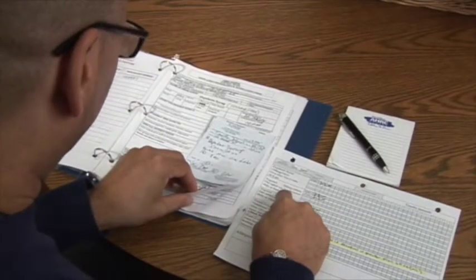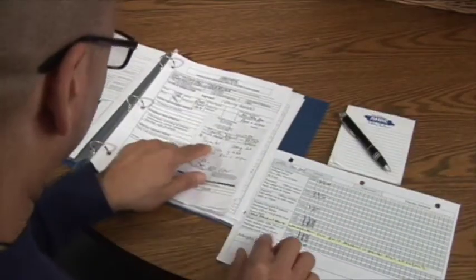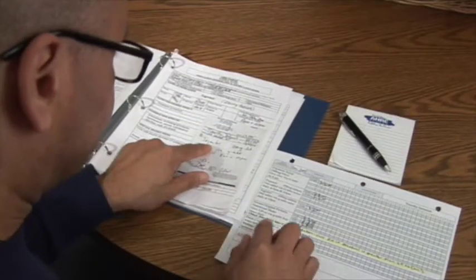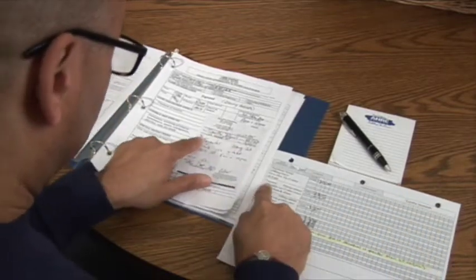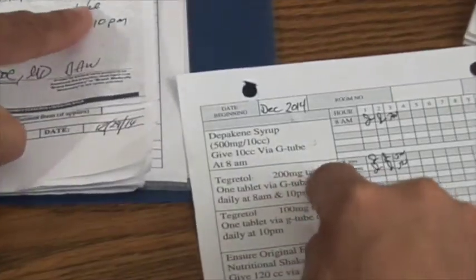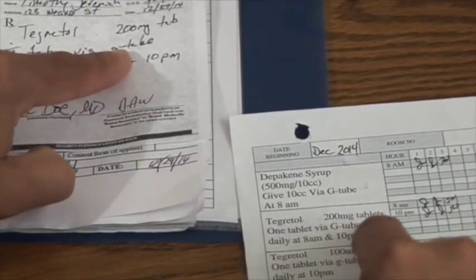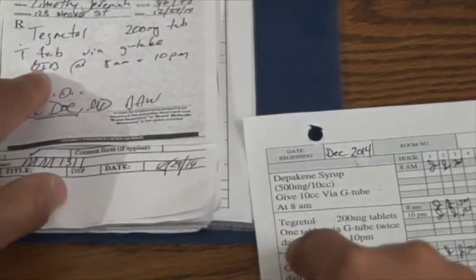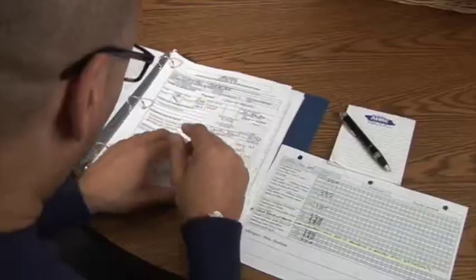Now I'm going to look for Tegretol 200. Timothy Jeremiah — Tegretol 200 milligram tablets — one tab via G-tube daily at 8 a.m. and 10. I'm giving 8 a.m. meds. It's for the treatment of seizures. Give with food to decrease GI upset.